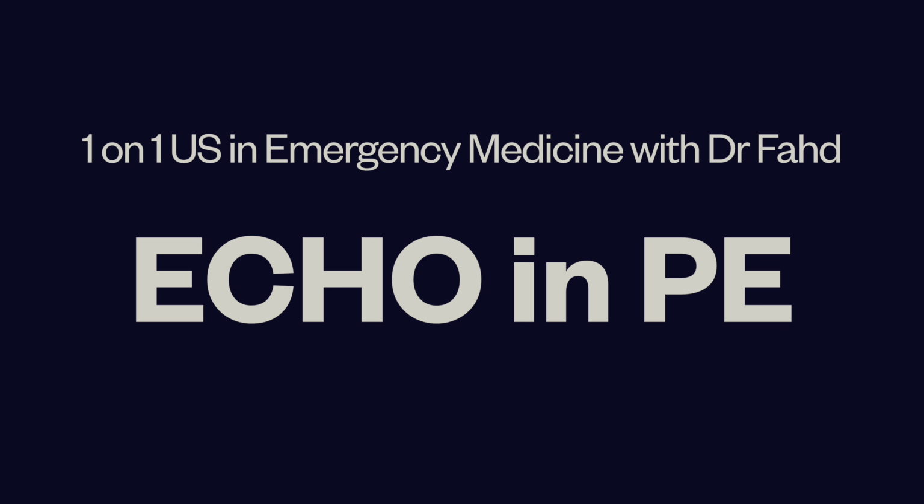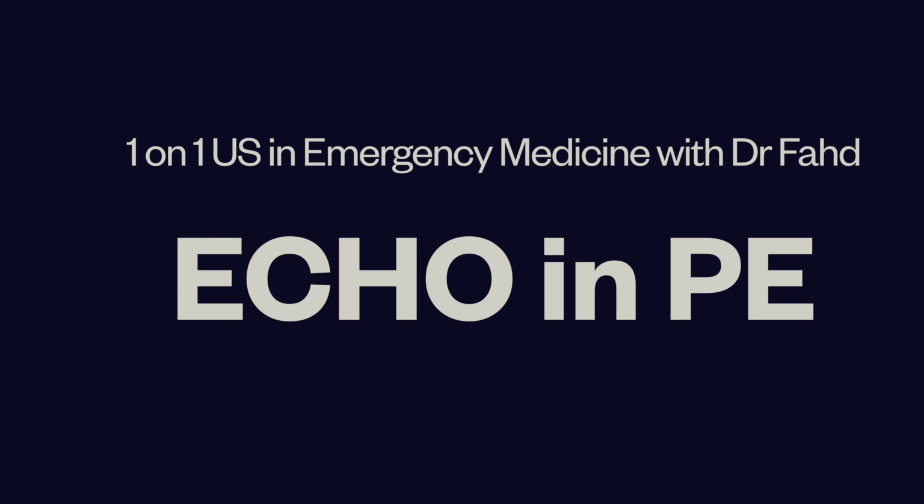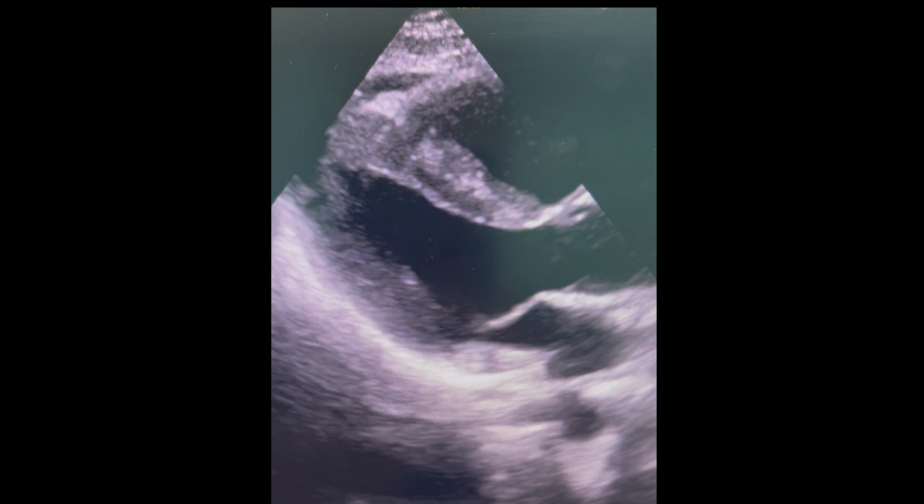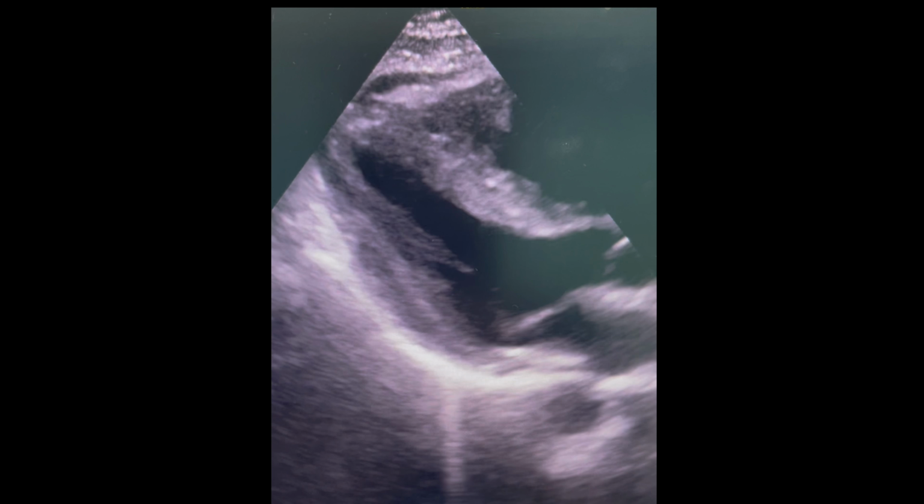Today, I'll be walking you through the key echocardiographic findings in pulmonary embolism. Echo doesn't diagnose the PE itself, but it tells you how sick the patient is and how urgently you need to act. The first view that you are about to see is parasternal long axis view.